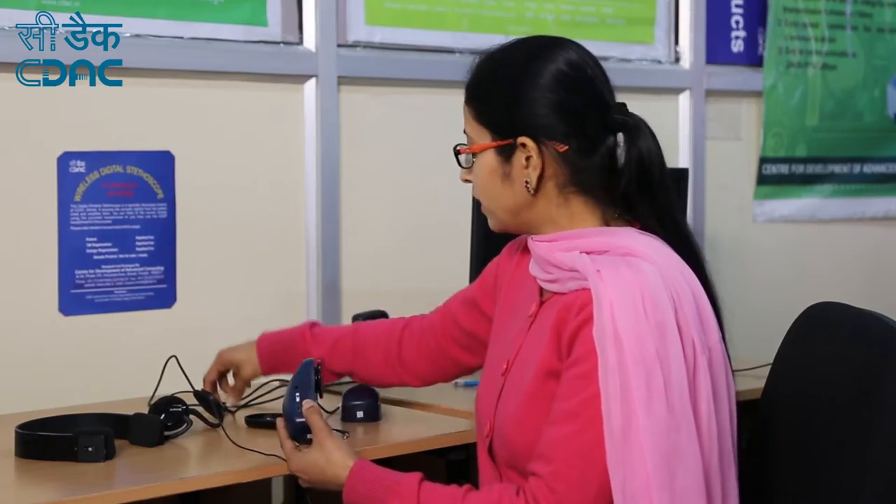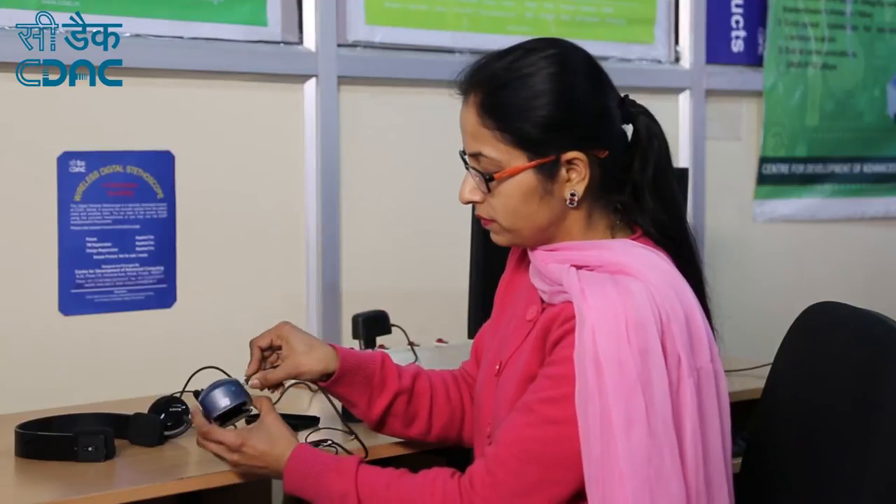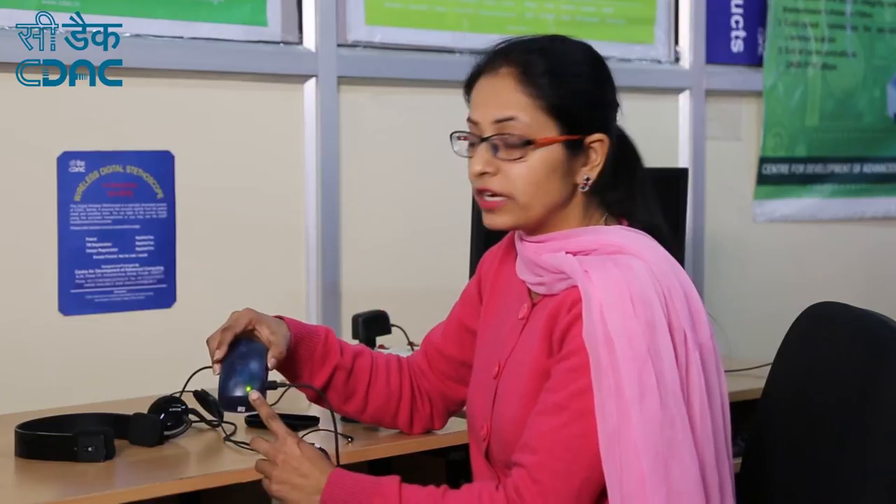Now starting with the charging of the device. Connect one end of the charger to the USB port and the other end to the AC mains. The green LED indicates that the device is getting charged. It will take 4 hours to get fully charged. Once the device is fully charged, the green LED will automatically turn off.